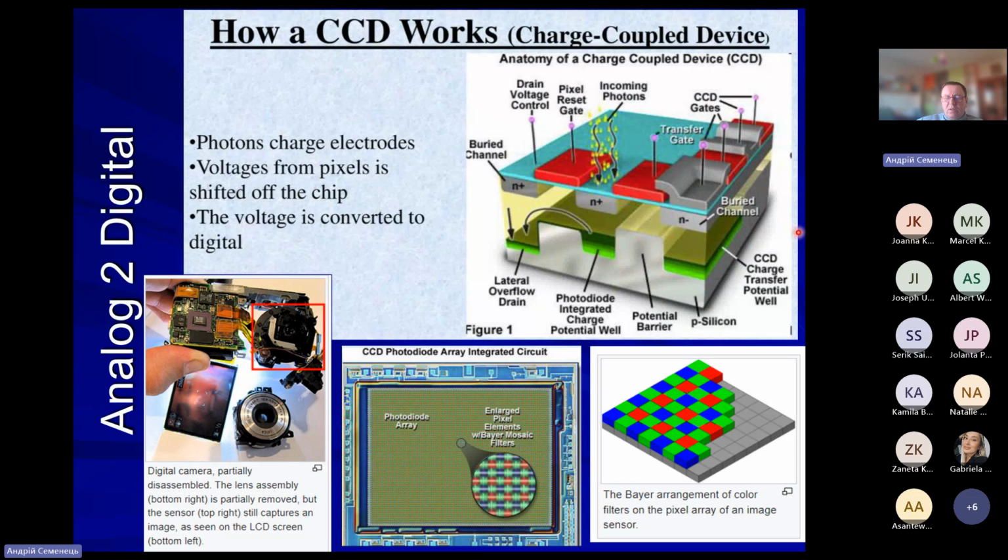Correspondingly, when we turn to the idea of how to digitize an image, as a conventional image is composed of pixels, we need a device which will be able to register changes of energy which come from the environment and produce some electrical response, some electrical signal, which will depend on the amount of incoming light, which is composed by photons, a stream of photons.